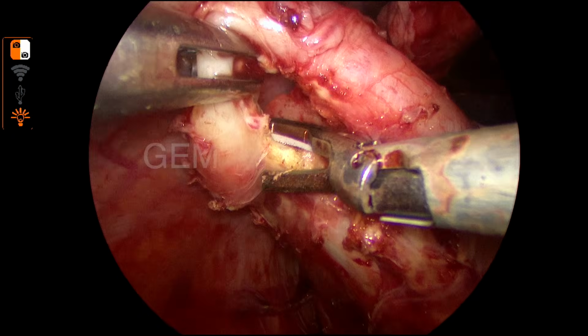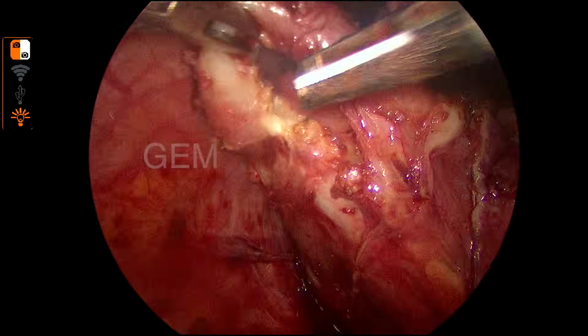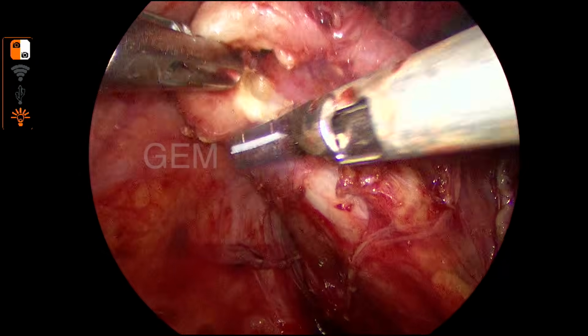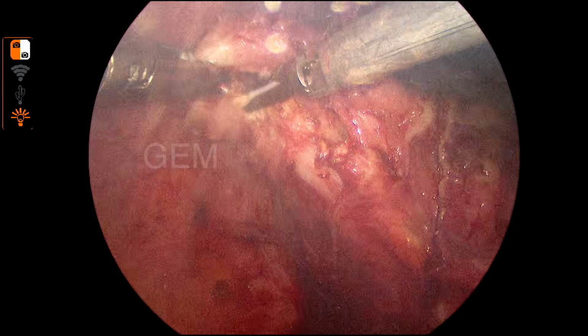I can go. I will get some space between the appendix and the cecal wall, and that's what I'm finding out, the space, and then I'm dividing the mesoappendix close to the appendix. As much as possible, try to go close to the appendix.